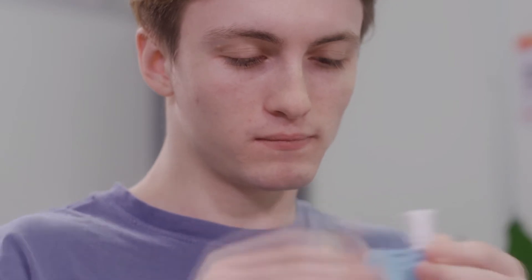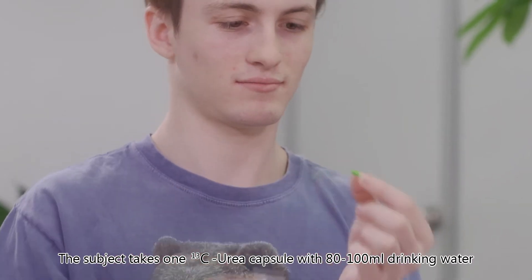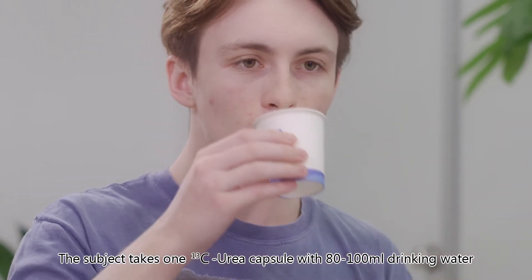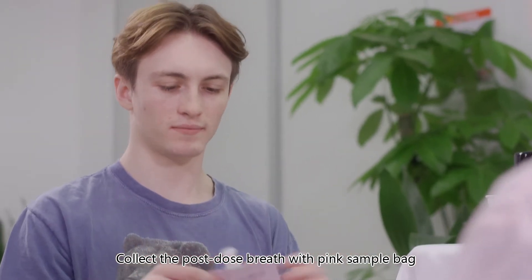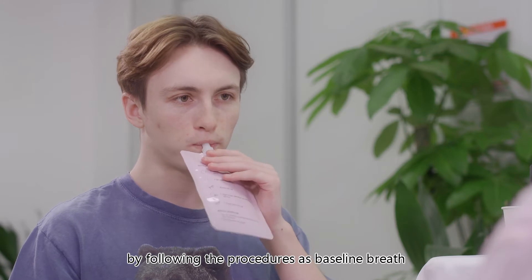The subject takes one carbon-13 urea capsule with 80 to 100 millilitres of drinking water, then sits still for 30 minutes. Collect the post-dose breath with the pink sample bag by following the same procedures as for the baseline breath.